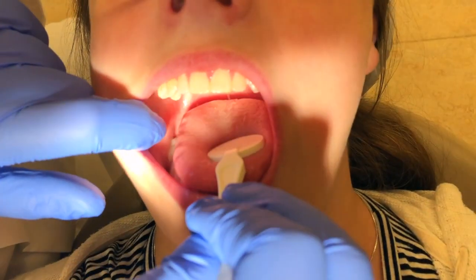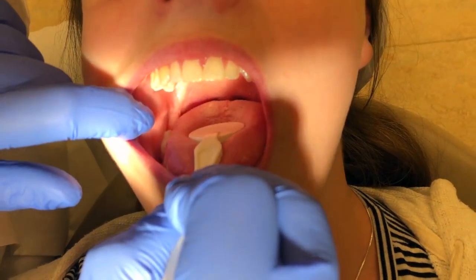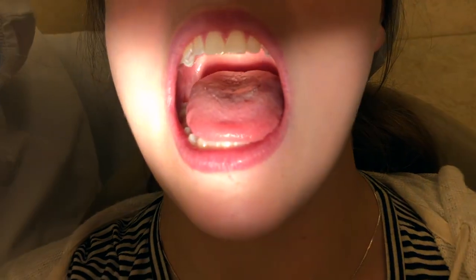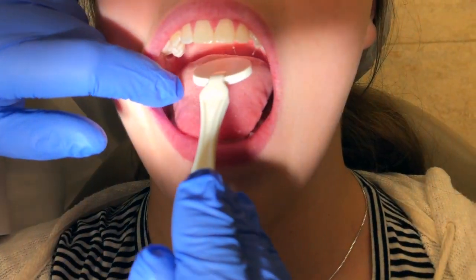Visually inspect oral pharynx and tonsil area. Using mirror to gently depress the dorsum of the tongue. Reveal oral pharyngeal area. Ask the patient to say ah if necessary. Again.